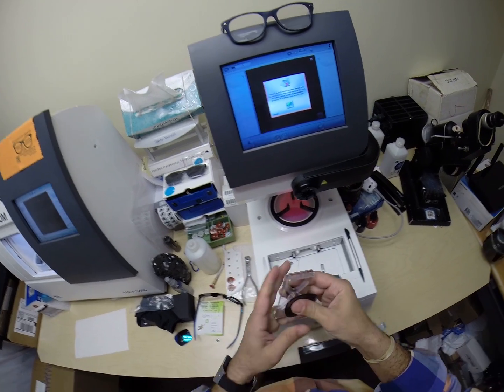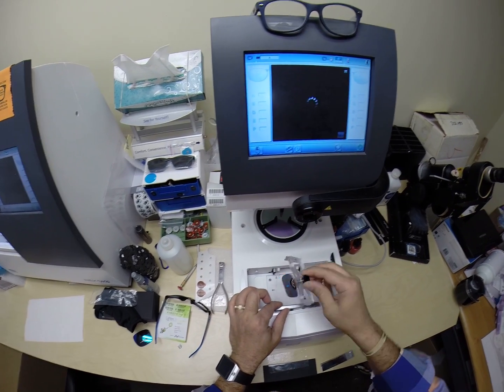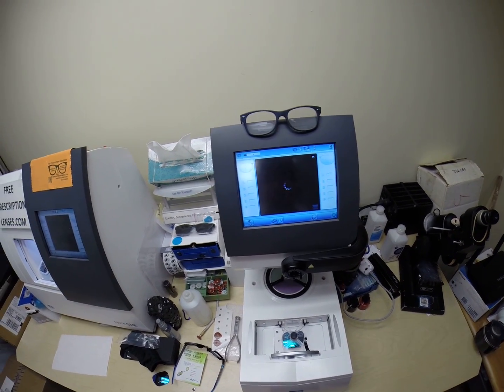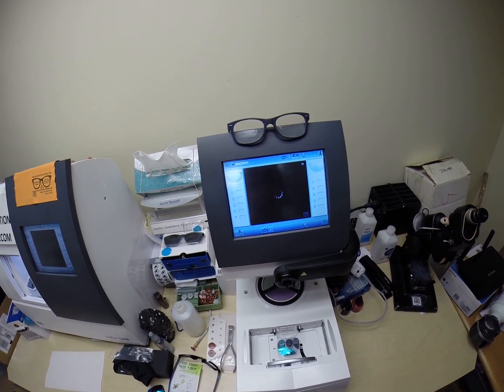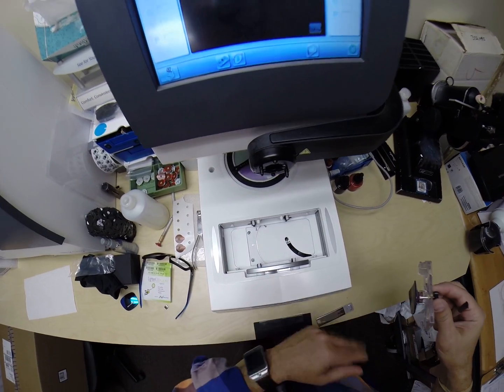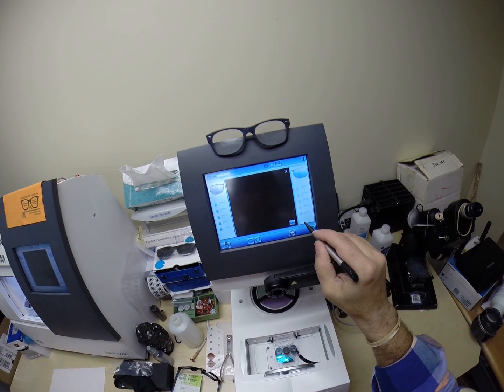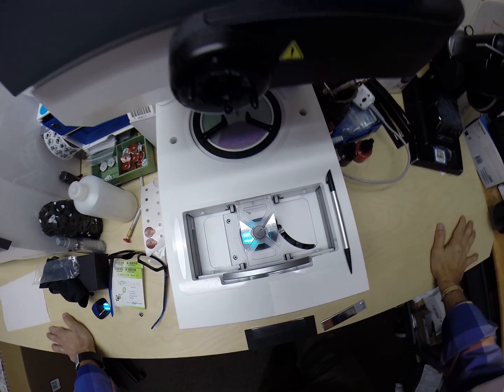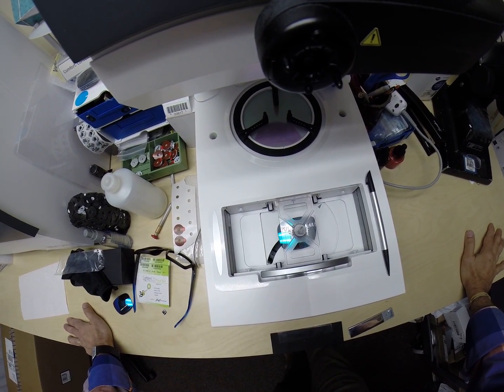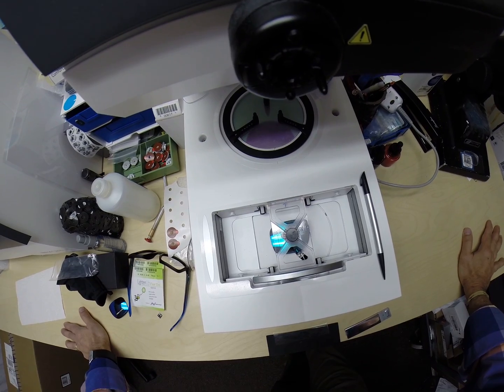Alright, we're going to put that on there. Reset the computer. Make sure everything's lined up in there perfectly. It's going through the motions. Come on now, come on. Now can we work? Okay. Right lens only. Hopefully the lens will stay on there this time, and we'll get a true tracing of the shape. It's always the first one in the morning that doesn't want to cooperate.